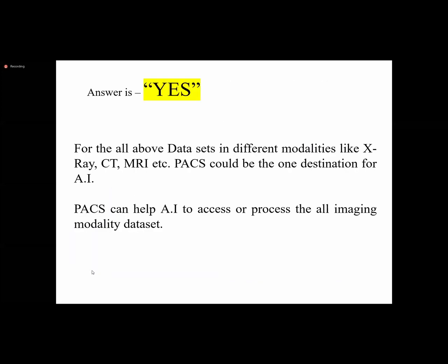So we can say proudly that each and every equipment can work with the AI, but the PACS will be the more suitable option because the AI needs the maximum number of data sets, and the maximum number of data sets in the radiology department we can get at one location only, that is the PACS system. But it doesn't mean that AI cannot work with CT or MRI. Independently, it can work with each and every equipment. But the more suitable option nowadays in radiology is the PACS, because at the one location or at the one station, AI can access the maximum amount of data from each and every equipment, and can also access and process the imaging modality.